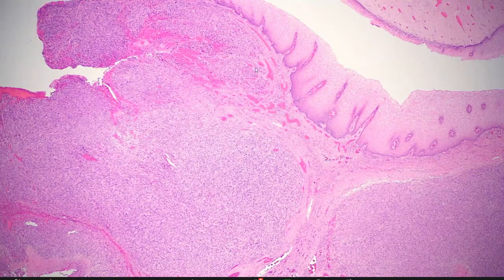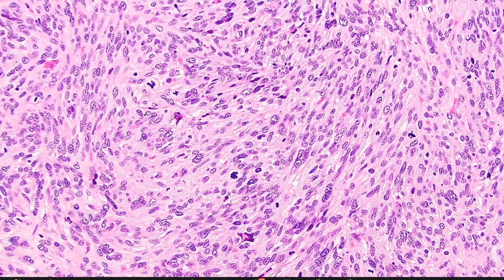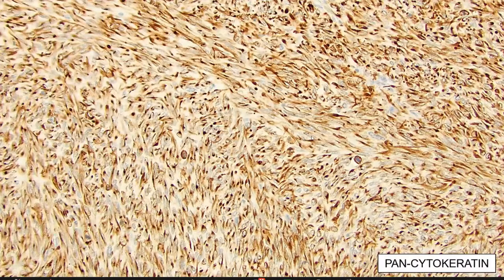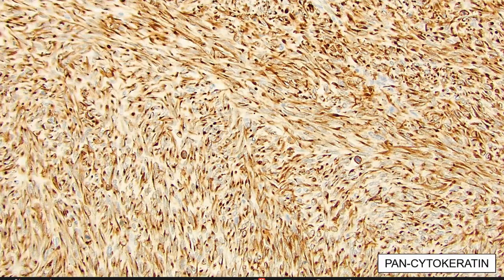This is a case I had a few years ago that presented as a very bulky uterine cervical mass. And you can see it has a very nice spindle, almost fascicular appearance, very atypical. It expressed smooth muscle markers, interestingly, and it was first misdiagnosed as a leiomyosarcoma. However, you can see the very strong cytokeratin expression, which led us to test this tumor for HPV studies and it turned out to be positive. Further sampling identified areas of more conventional squamous cell carcinoma.